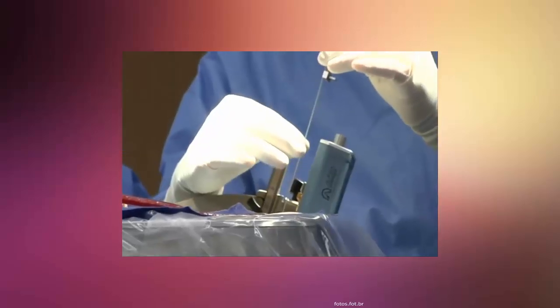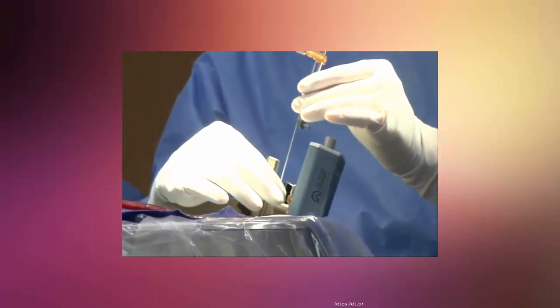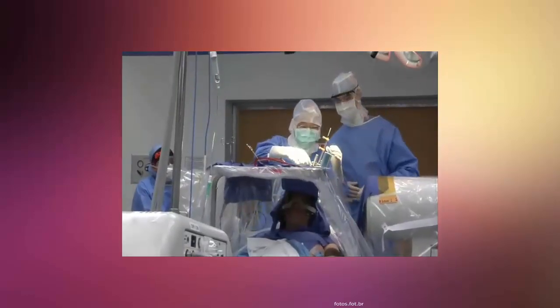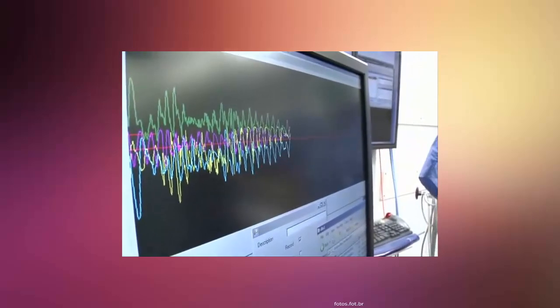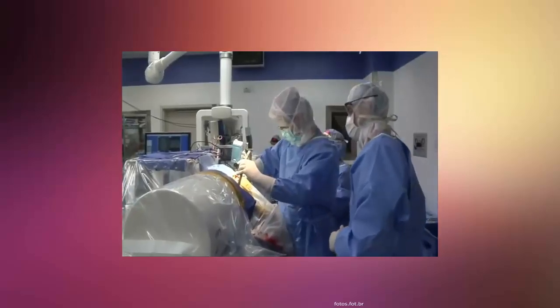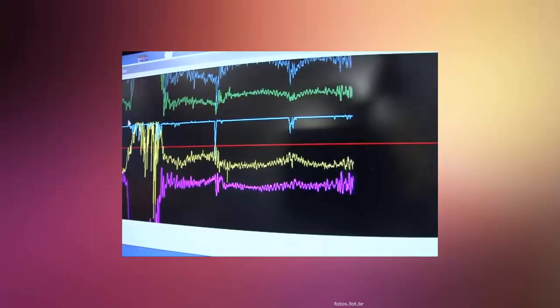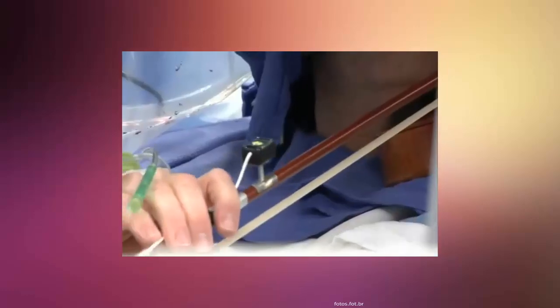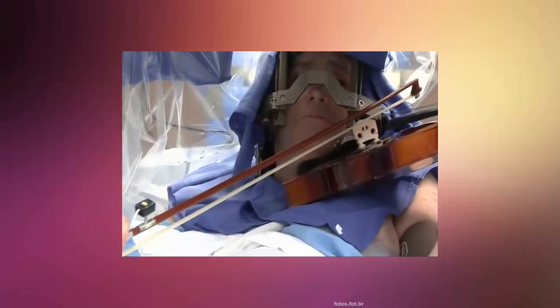But there was a challenge to overcome that created a first-ever situation in an operating room. You see, because Roger's tremor was so small, it would be difficult for Dr. Lee and his team to tell if the electrodes they were implanting were in the best possible place to stop the tremor. "And so what we needed is we needed a violin in the operating room." Kevin Bennett heads Mayo Clinic's Division of Engineering. His team worked with Dr. Lee's team to create a violin Roger could play while awake during surgery.